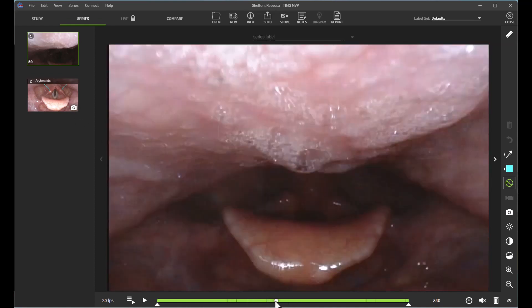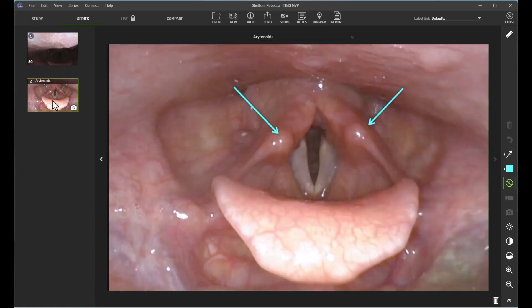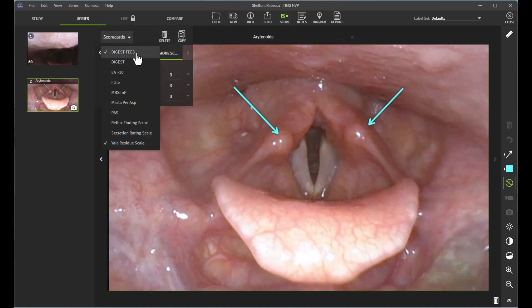After I have gone through and reviewed every aspect of the FEES study and taken my snapshots, I'm going to go ahead and start scoring my study. I can do so by clicking the score icon here, which will open my scorecard. I've already done some scoring, but to review — you click the dropdown arrow and select which scorecards you want to utilize for your evaluation.